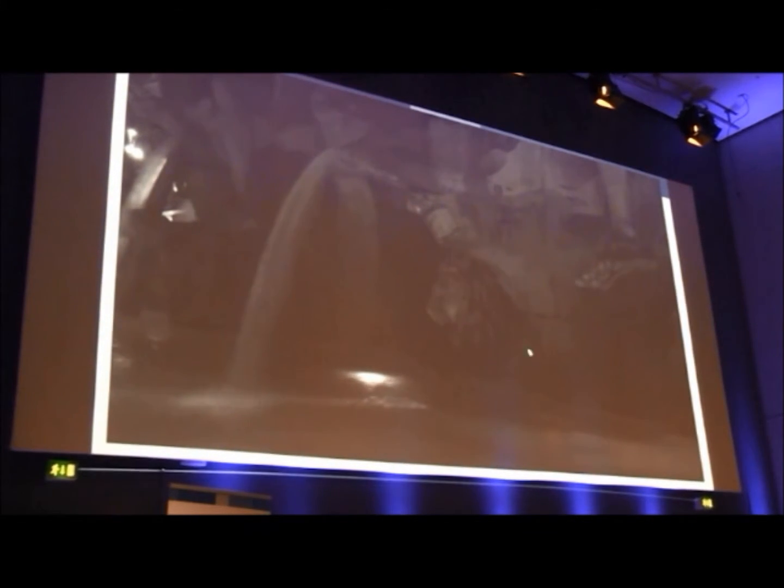So here you've got the fountain. Let's say that's the RPE. Here you've got this lion head. Let's say that's a fibrosis on the RPE. Here you have a vessel, and the light is the OCT laser source. Now, as you can see, this movement causes a flickering on this highly reflective surface.